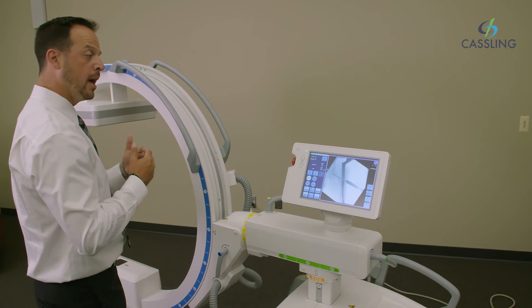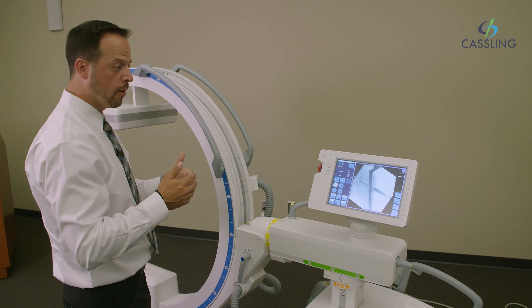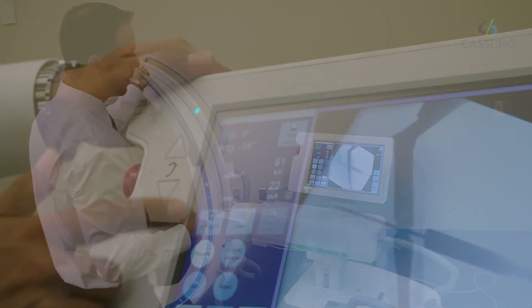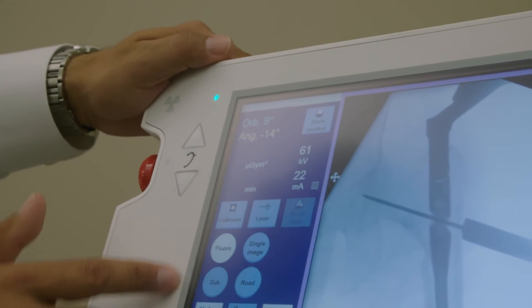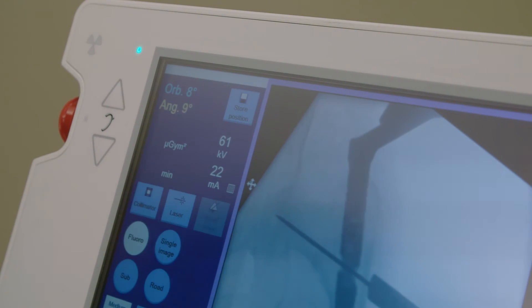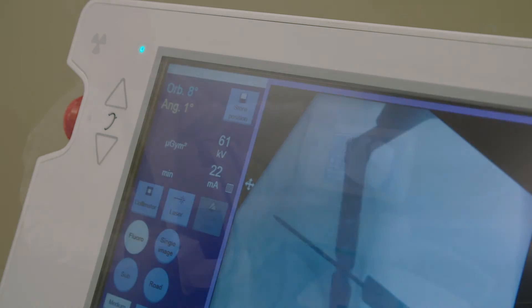You also have the ability to tell what orbital degree or angular degree you are in, right here in the top left corner of the screen. As I'm moving the orbital degree and angular degree, it keeps a precise reading letting you know exactly where we are.